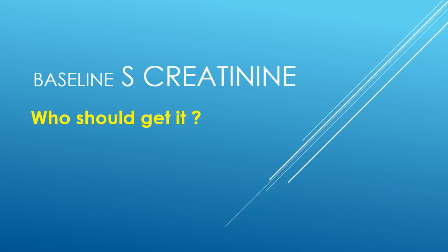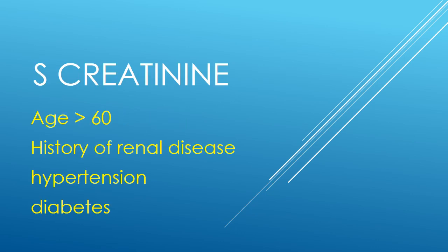The most common question that everybody will ask us is, do I do serum creatinine as a baseline for all patients who are going to undergo a contrast CT study? Now, no need. No need to do serum creatinine in all the patients. You should do it whenever the age of the patient is more than 60 years, wherever there is a history of renal disease, hypertension, and diabetes.